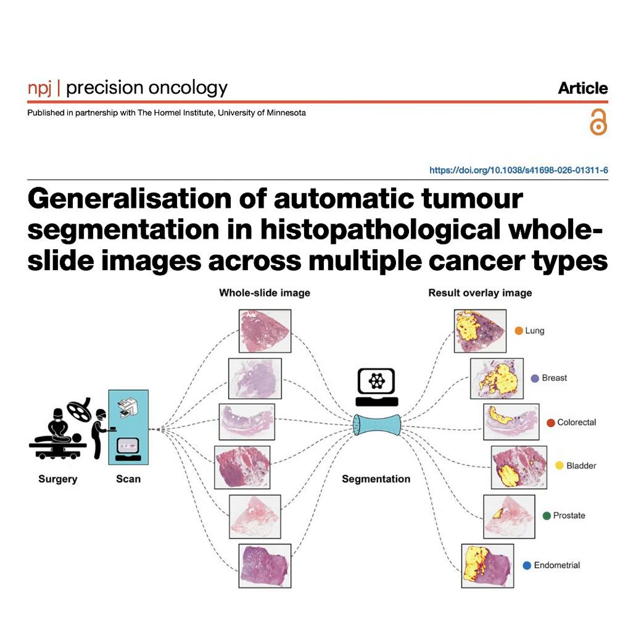Wow. If we connect this to the bigger picture, this really highlights a critical limit of where medical AI is currently sitting. It really does. This pan-cancer model is perfectly tuned for solid, en-bloc resections, meaning large, intact chunks of tissue removed during major surgery. But it struggles deeply with fragmented biopsies. Right. And the obvious reaction from anyone looking at this is, well, just lower the threshold, make the post-processing more sensitive. And you could do that, right?